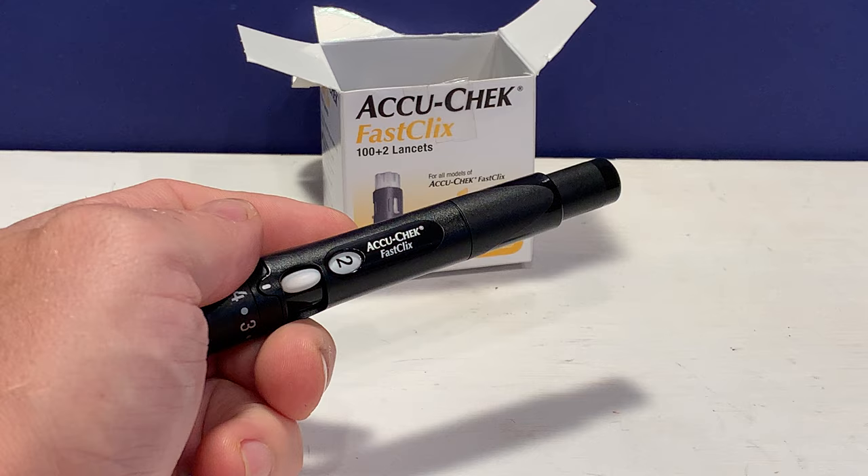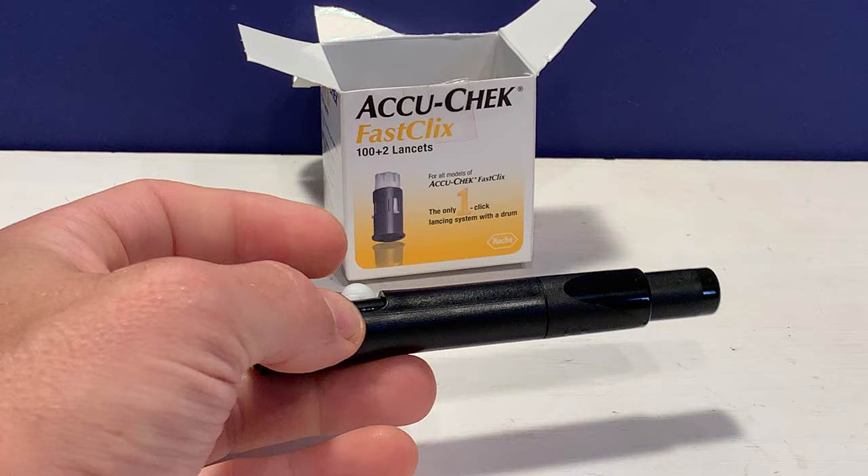Hi, Josh here with PharmacistTips.com. I'm going to show you how to change the AccuCheck FastClick drum — the lancet drum.